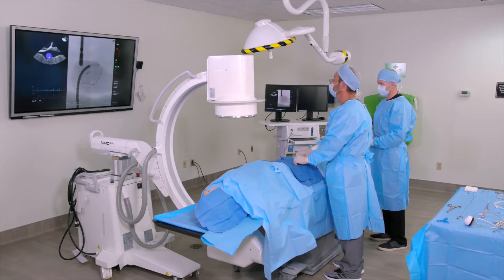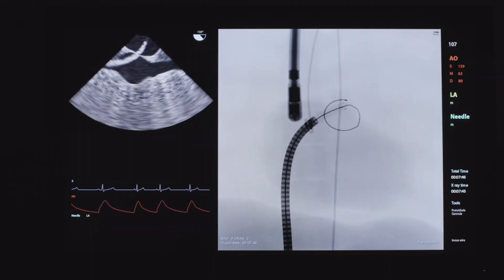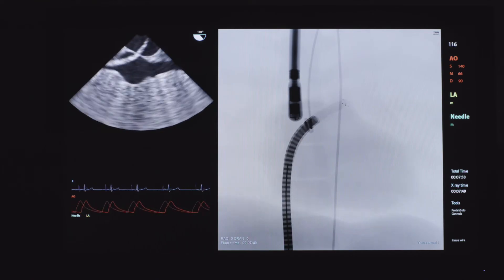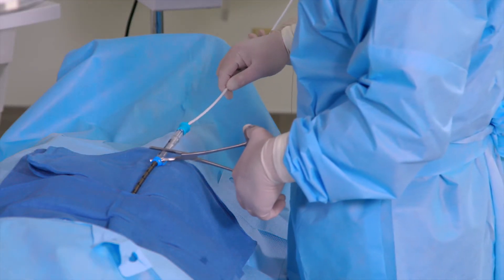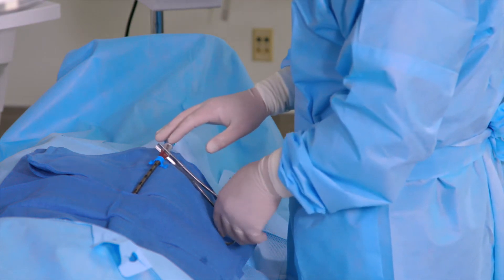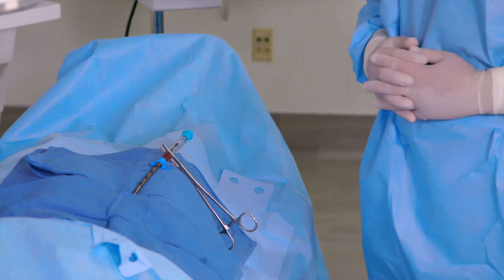Confirm adequate volume exists in the left atrium. Next, remove the guide wire and introducer until they are beyond the clamp area of the cannula. Then, leaving the hemostasis cap in place temporarily to control blood loss, clamp the cannula in the clamp area and remove the introducer, wire, and hemostasis cap from the cannula.